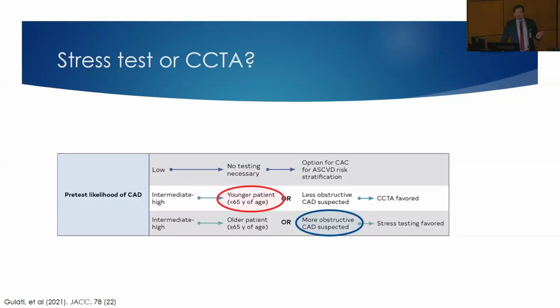So these sort of patients are best favored by an ischemic driven evaluation, which would be doing a stress test, not doing an anatomic evaluation. But if they're younger, they're going to have maybe some scattered calcific plaque. It'll be easily interpretable with a high level of accuracy. So for those patients, coronary CT is a great idea, but just be careful about the patients you refer if they're elderly, because you might end up sending them inappropriately to a heart cath.